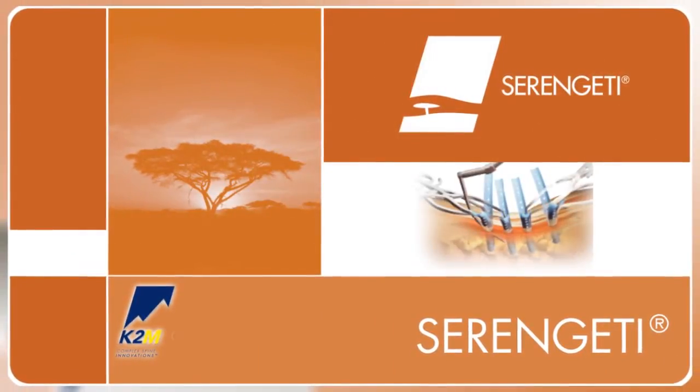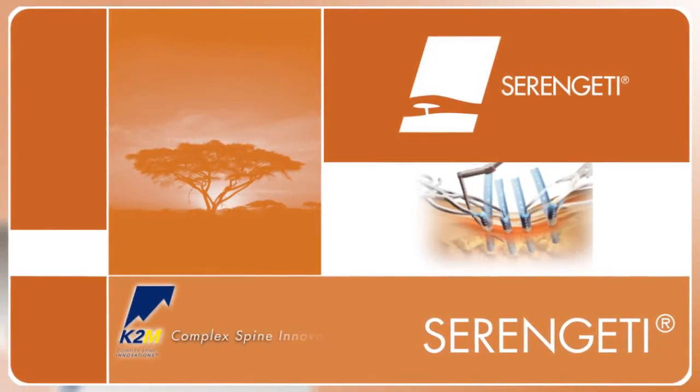Introducing the Serengeti Minimally Invasive Retractor System from K2M, Complex Spine Innovations.